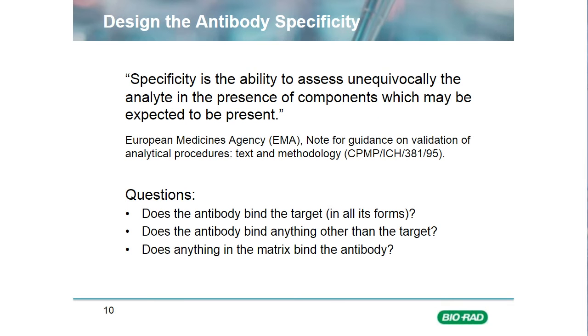So let's start with specificity. The European Medicines Agency defines specificity as the ability to assess unequivocally the analyte in the presence of components which may be expected to be present. And really we can break this down into some more basic questions.